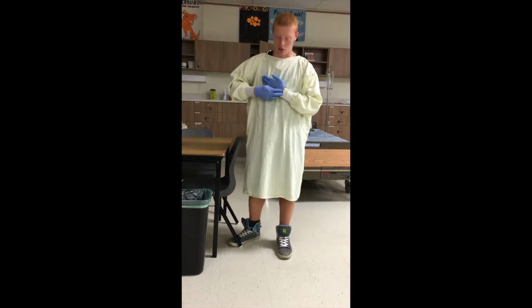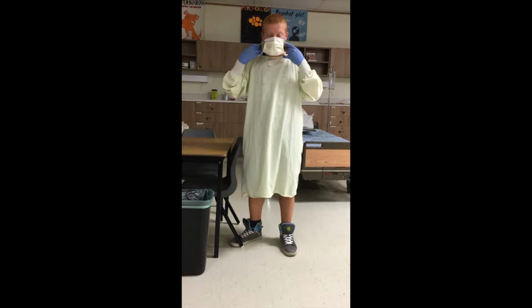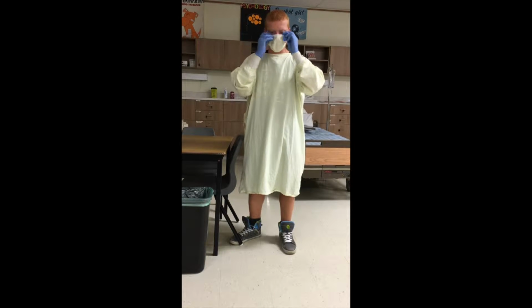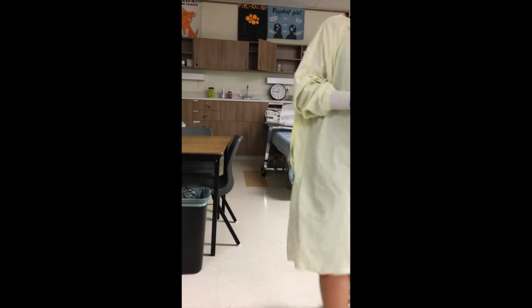And then before you enter the room, you want to make sure that your mask is on so you're not a risk to the patient or yourself. And you enter the room and you're ready to interact with the patient.